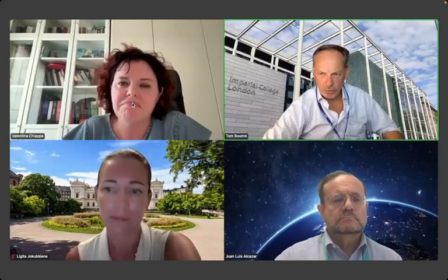So there are always exceptions, aren't there, where it's very, very difficult. There are a couple of questions. I'm mindful it's now 2:00, so very quick answers, if you wouldn't mind. Some people are keen on elastography. Cancer of the cervix, any experience? Yes, no, maybe? Fairly short answer.